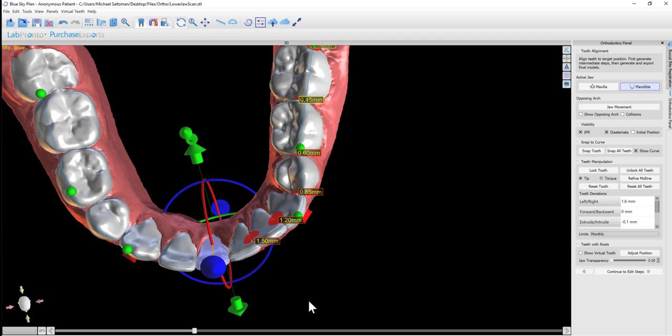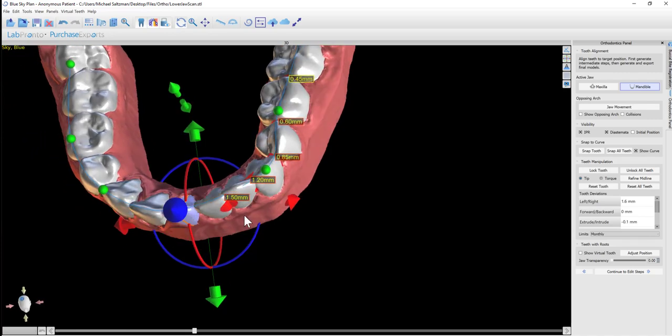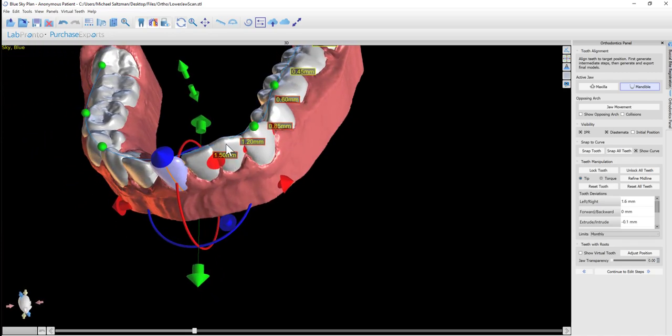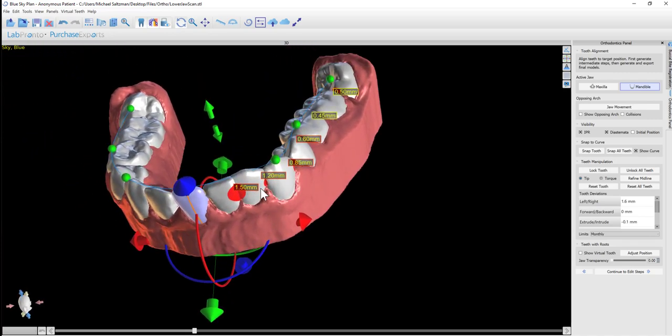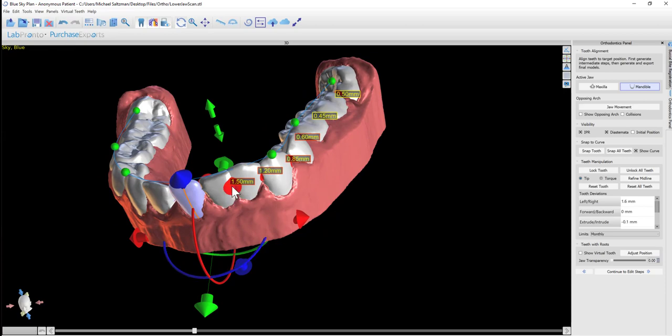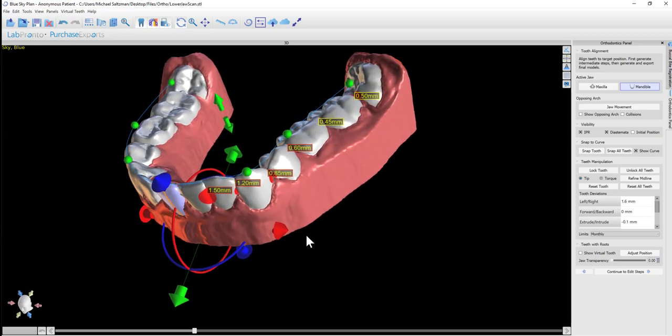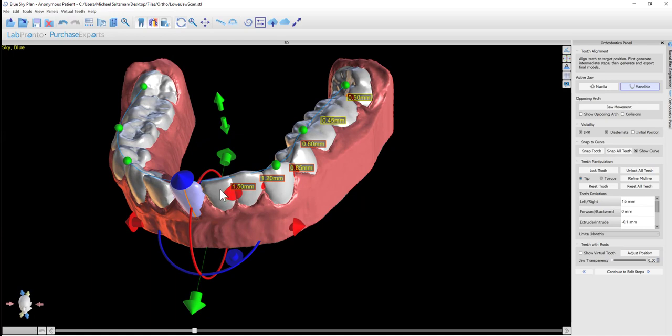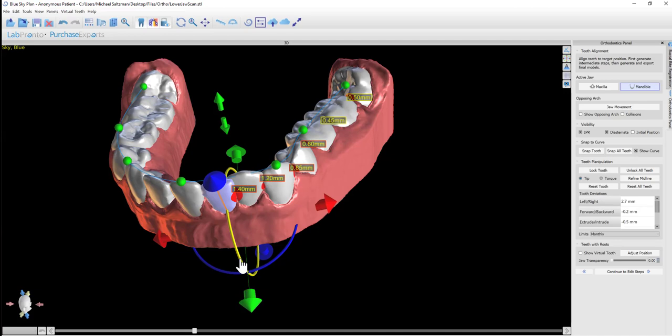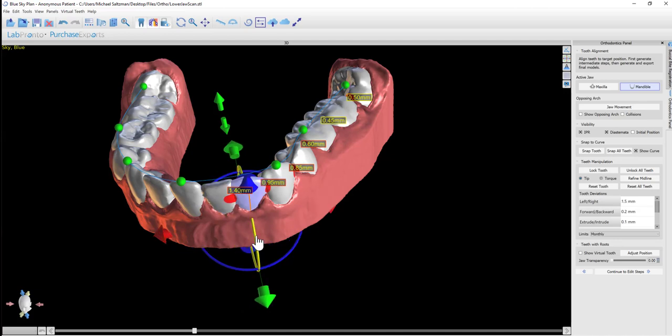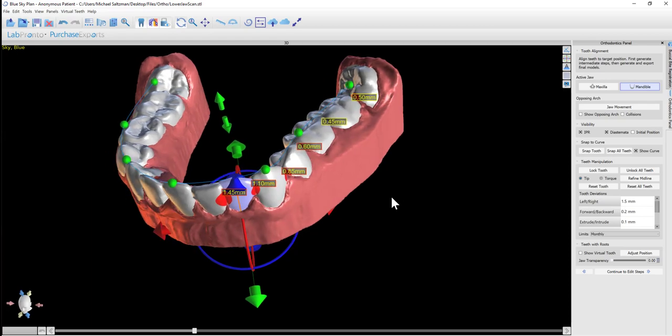The software has snapped the teeth to the curve, but it's telling us that it wasn't able to do so without going over the maximum IPR limit. Our options are: we can position the teeth manually, we can change the curvature of the curve and re-snap, or we can change the maximum IPR if we feel that's appropriate in the situation. The software is coloring and highlighting in red the areas of the IPR and showing us the amount of IPR. If we click on a tooth and modify the positioning, we see the IPR changing in real time. We'll also see the spacing between the teeth if there's space created.